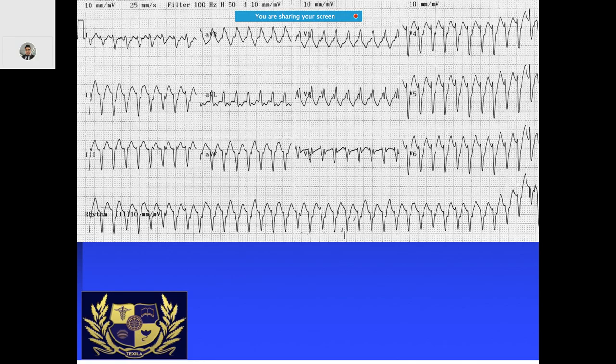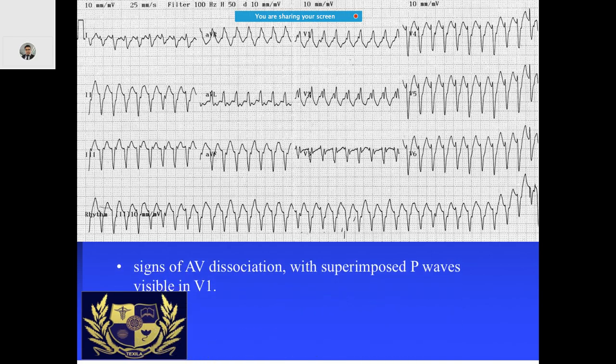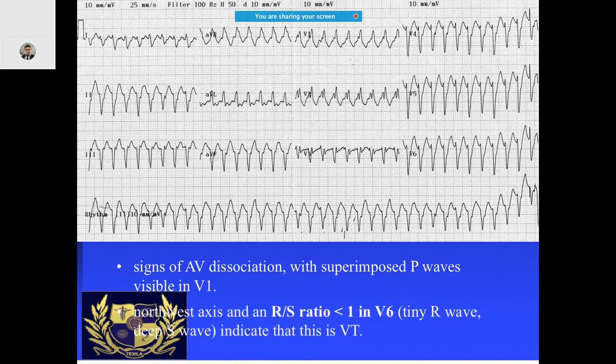Looking at this ECG, if you look carefully especially in lead 2 or the rhythm strip at the bottom, you will see AV dissociation. There are superimposed P waves especially in lead V1. That is why if you come across an ECG like this, it is ventricular tachycardia.